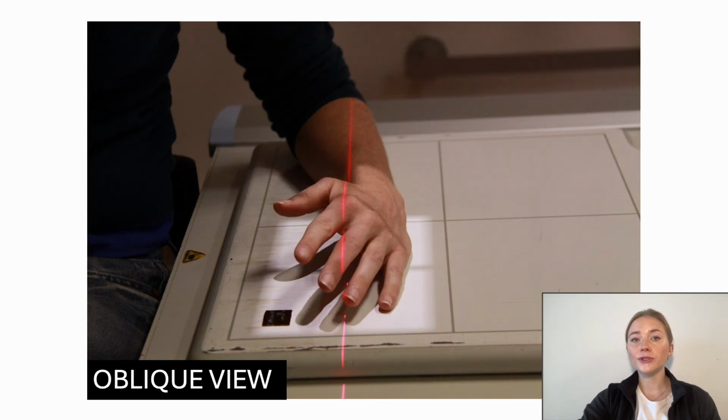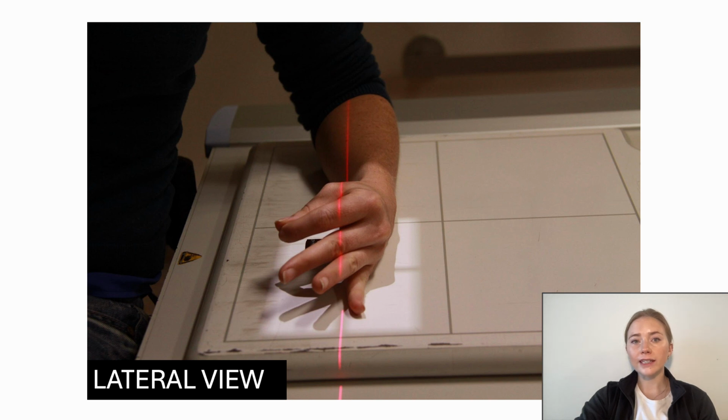The oblique view is used to see a variety of conditions, including arthritis, fractures, dislocations, and foreign bodies. It involves raising the radial aspect of the hand from the PA position. Finally, the lateral position is 90 degrees from the PA view and can help determine fracture displacement, which may not be obvious from one view alone.